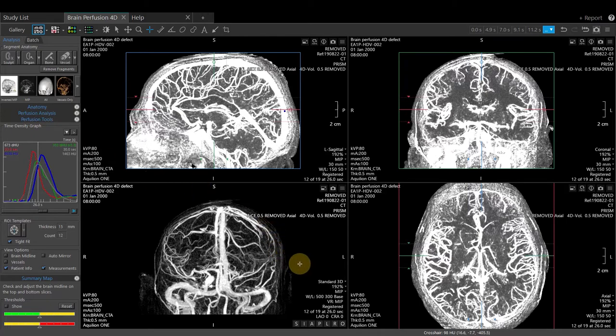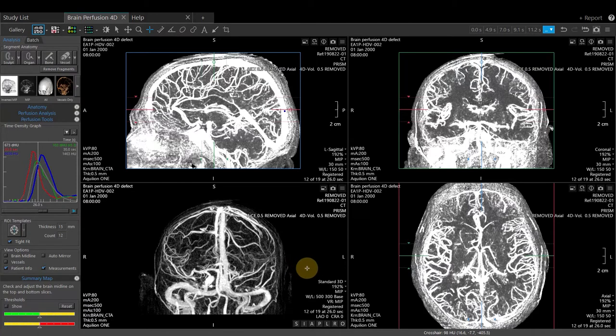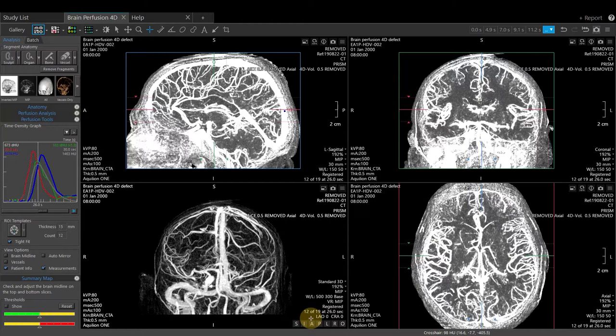Rotate the 3D image to the appropriate projection by right-clicking and dragging, or use the 3D preset anatomic defaults at the bottom right-hand corner.